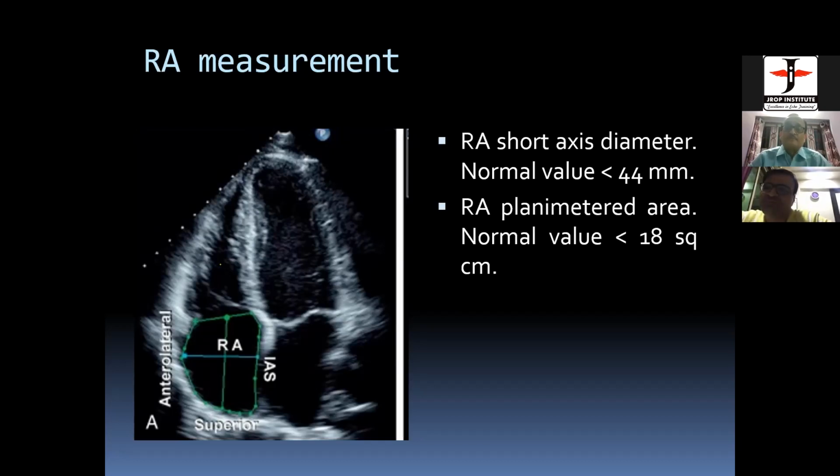Okay, sir. Yogesh, there was a time when we never had two dimensional echocardiography. So what was E-point septal separation? When E-point septal separation was more than 7 millimeters, we thought the LV was dilated. Then we had mitral stenosis. When mitral stenosis was there, mitral valve opening was restricted, so D excursion was reduced and EF slope was prolonged. Those are the periods when we talked of echo in M mode during the 70s.